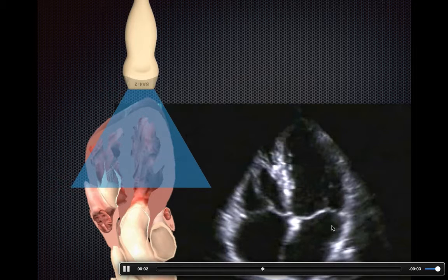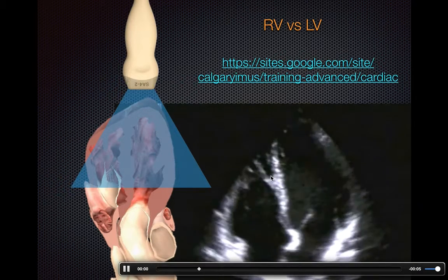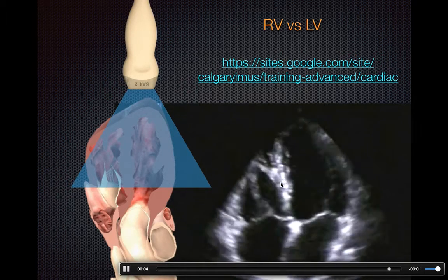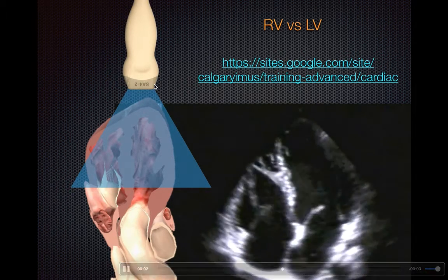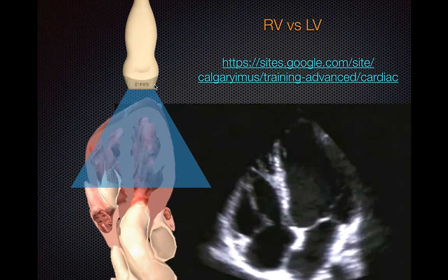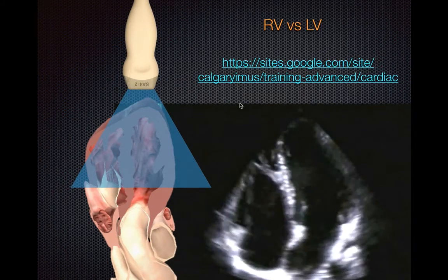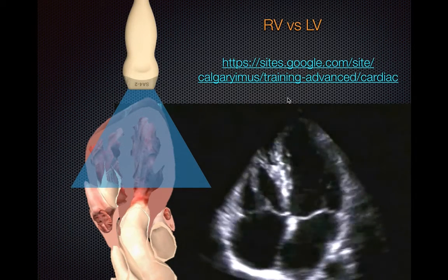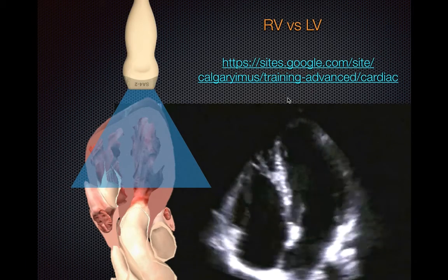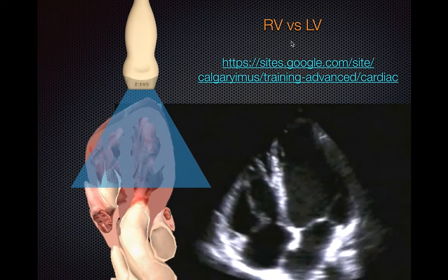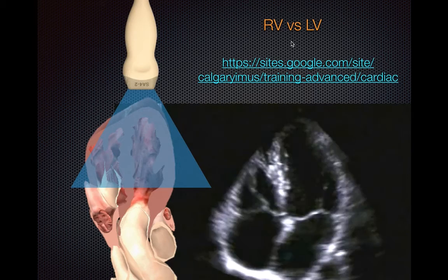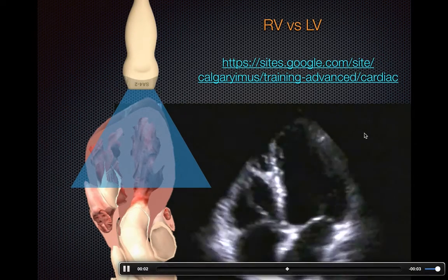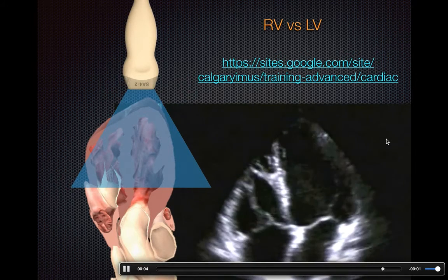Going through the anatomy, you can actually see a bit of the moderator band in the right ventricle. People frequently get the right and left mixed up, especially if the transducer marker isn't oriented correctly. I'll direct you to a tutorial on our website — also on the MGH Emergency Ultrasound website — that goes through all the salient features to differentiate the right ventricle from the left ventricle.